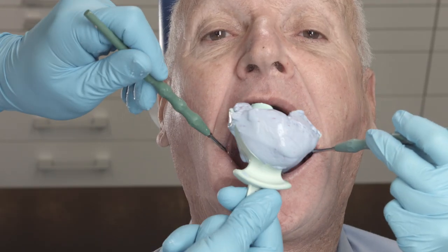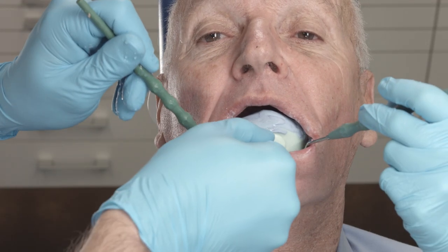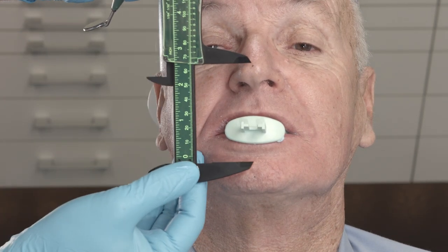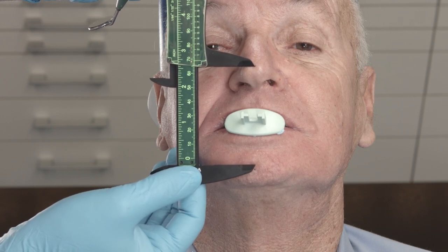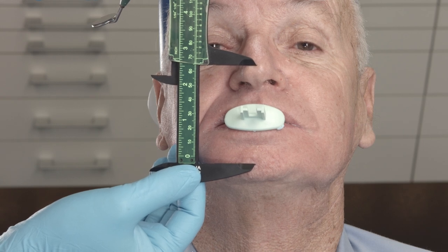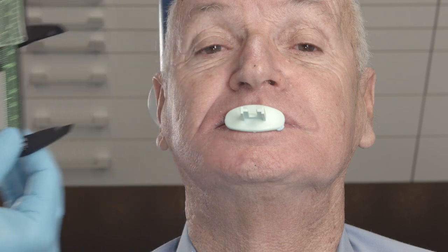Rotate the centric tray into the mouth moving from top to bottom. Place the ridge on the lower alveolar margin. Ask the patient to close the mouth slowly until the distance measured with the calipers is attained. Now ask the patient to swallow. This will prevent strong protrusion of the lower jaw.